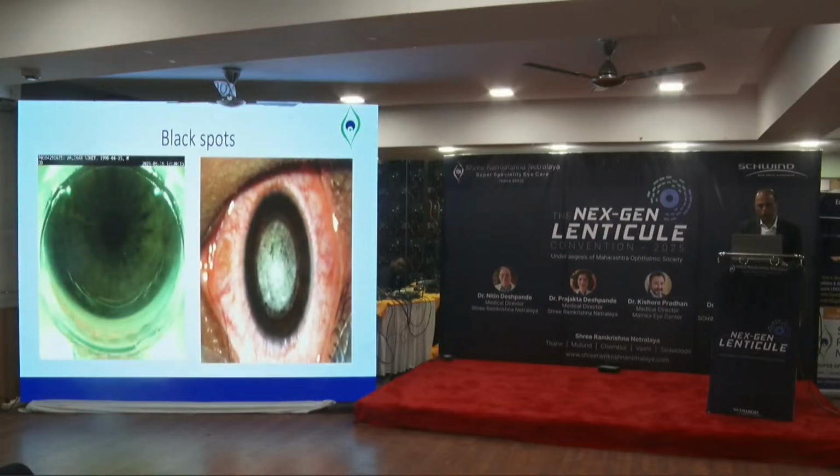The next is black spots. Now black spots can be because, if you try to re-dock again and again, your meibomian secretions will just go and sit there, and if you don't notice that, this is what you get. So it's better to abort, clean the interface and then go in.